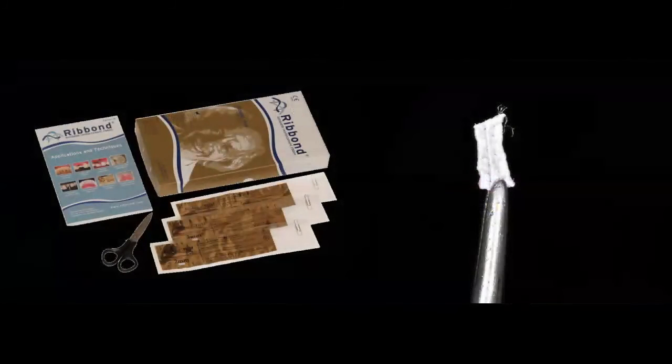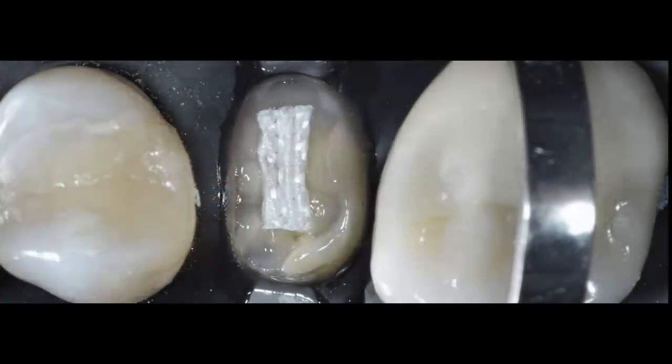So while I'm waiting for those 4 minutes, I go ahead and section my fiber. I'm using Ribbond as my polyethylene fiber, and you can see that I've cut my fiber.